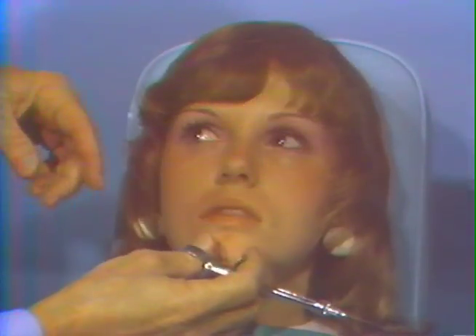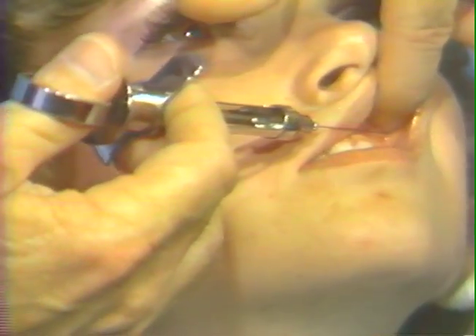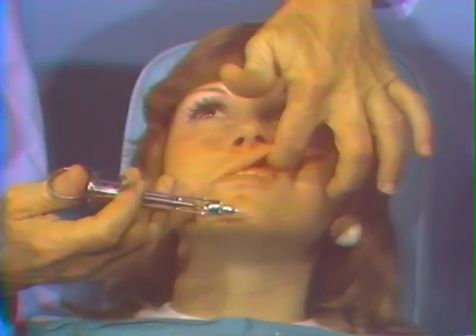As we demonstrated for the anterior section of the maxilla, for infiltration of the tissue, you may utilize the opposite sides of the midline. Horizontal type injections will be made in this manner here. Tip your head up a little bit. If I care to infiltrate and anesthetize the left anterior section with topical analgesia to the right of the midline, the needle may be placed horizontally in this position and passed in this direction, submucosal. This avoids contact with the periosteal membrane of the bone and is much more comfortable.